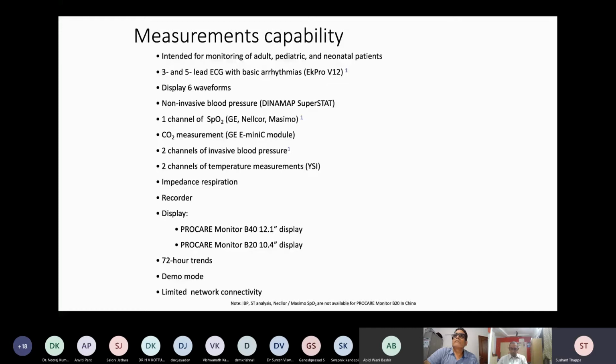I think as a doctor or as a person who works with healthcare in general, that's the bottom line of it. What we're trying to do is put our customers and patients at ease, and secondly, improve outcomes through these machines and through the technology that we are bringing into the hospitals. So when you hook up these monitors to larger displays, that really helps the patient also to see, okay, things are going right or things are going wrong. So it becomes a little more transparent in terms of process.